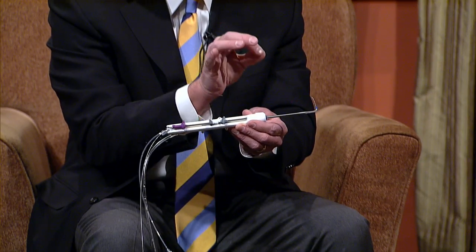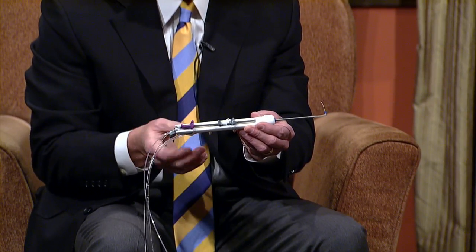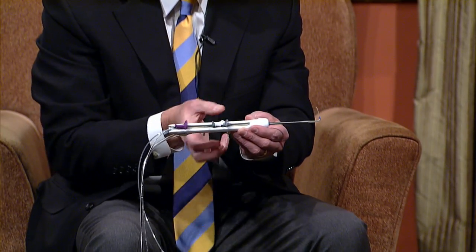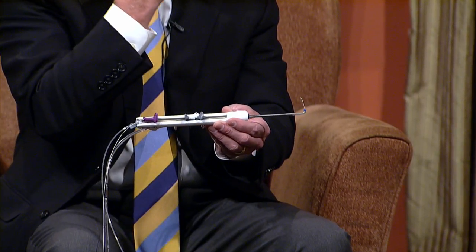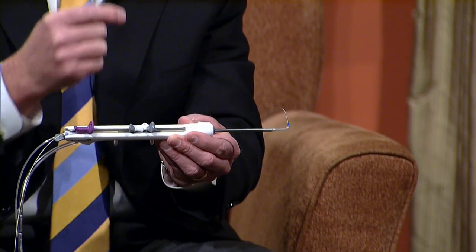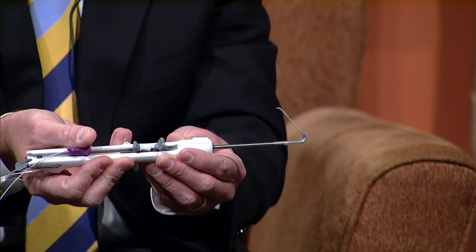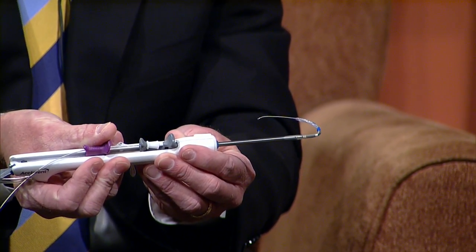This device is really neat — it has a little guide wire that's actually attached to a fiber optic light. You can pass the wire out the tip, and it's a very soft wire so it can't pass below the mucous membrane; it will find its way and sneak into the sinus opening. Once we're in there, the light on the end allows us to see that we're in the sinus cavity. It trans-illuminates — you'll see a bright red outline of where the sinus is, confirming you're in the right place. Then you simply pass the balloon over the wire into the sinus cavity.